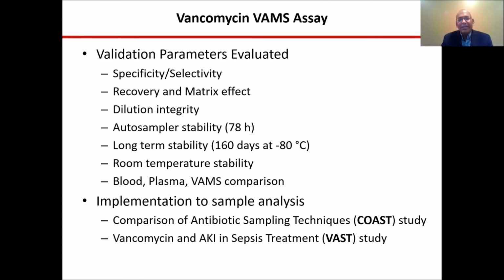And without getting into a lot of details, we went through and completed a series of standard validation experiments to evaluate specificity, selectivity of the method, and also look at the recovery and matrix effect of the extraction conditions, and look at the dilution integrity to make sure the samples would provide a reliable number if they have to be diluted, and also look at auto-sampler stability to make sure that in case of any reanalysis, the data would still be reliable.